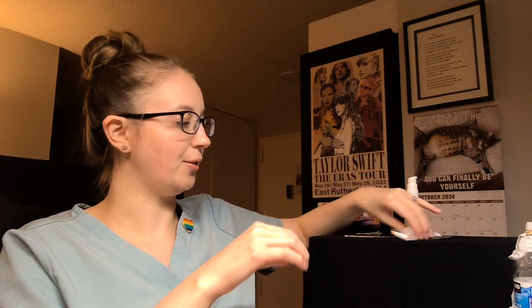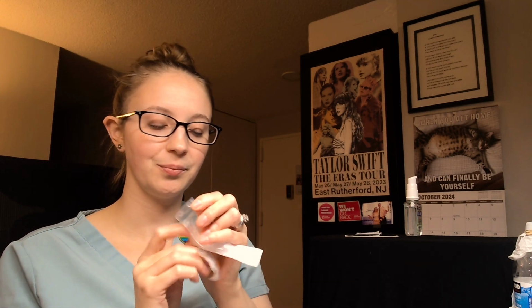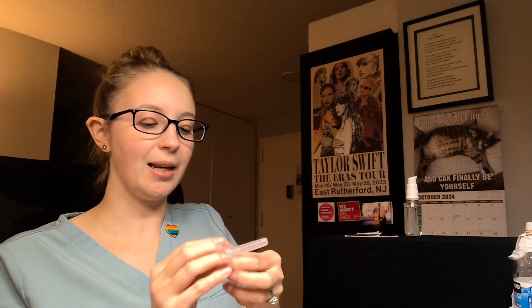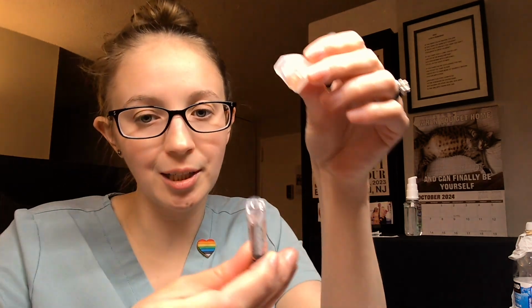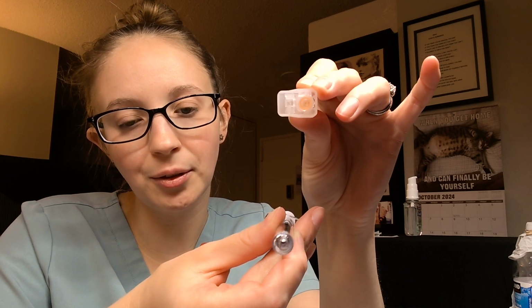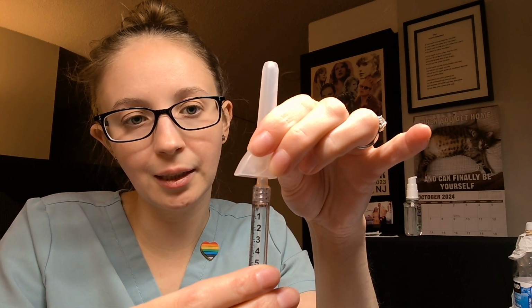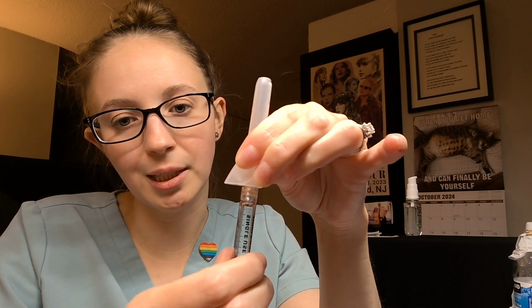Now we're going to pull out our 25 gauge needle. This is what we're going to inject with. It's much smaller than the 18 gauge. And it goes on our syringe just like before. See that little donut hole? So we put it on like that, and then you twist to lock it in.